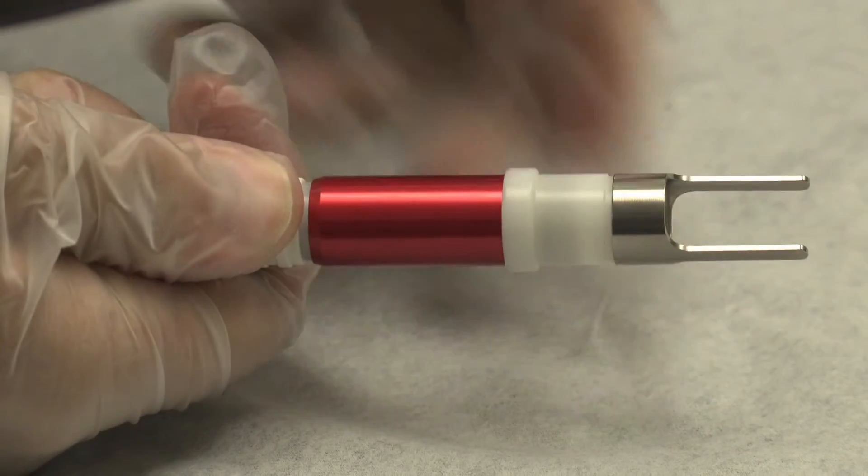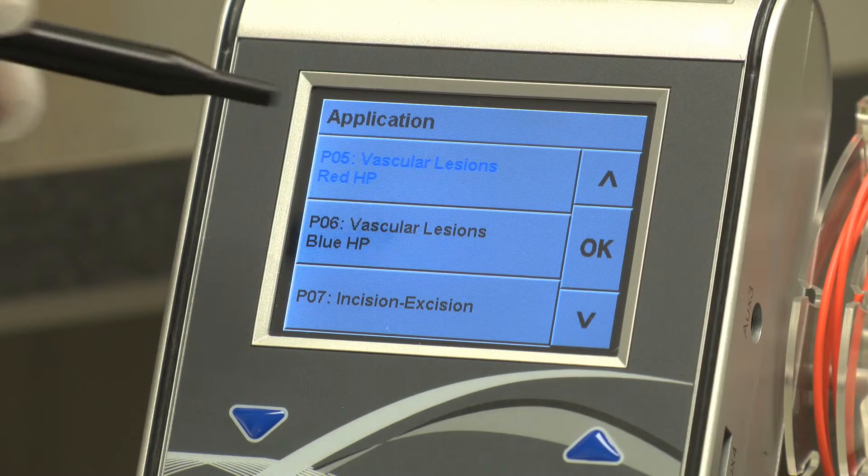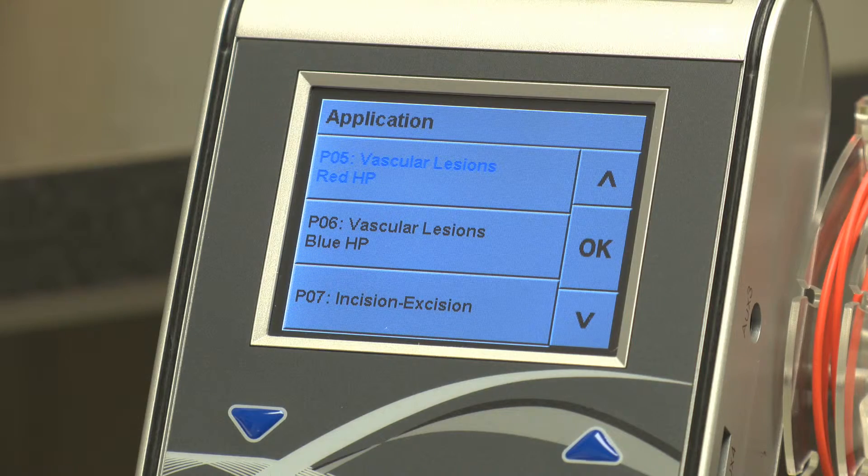For most patients, the red handpiece is most appropriate. Next, select the preset application that matches the handpiece you are using. In this case, it is red.